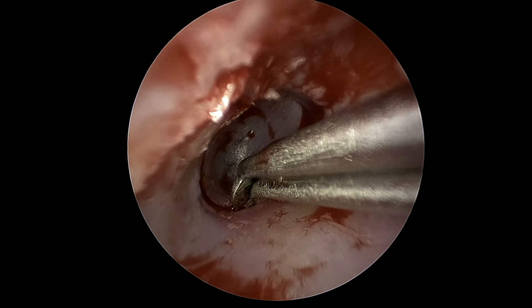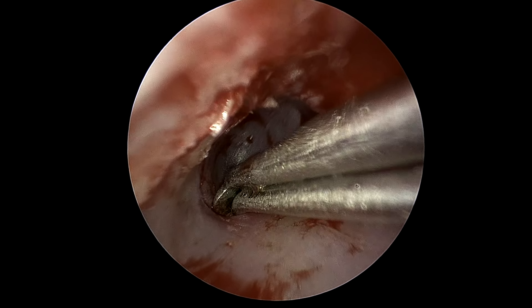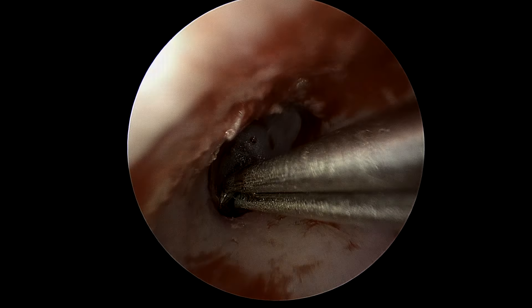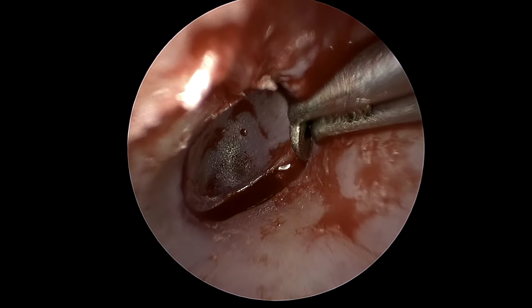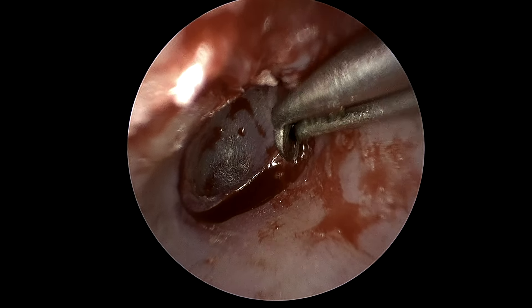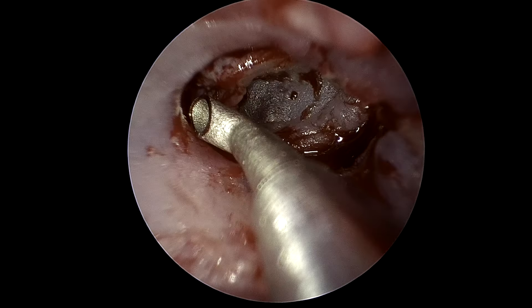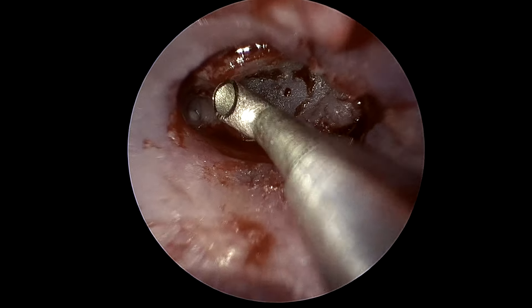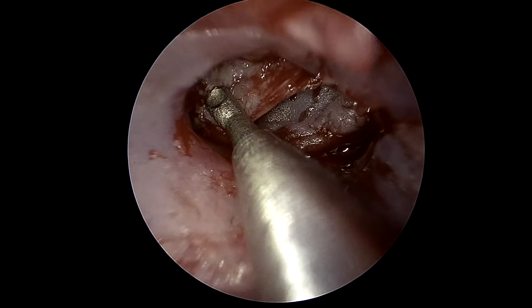Using a suction round knife, we then proceed to elevate the canal skin. Switching to a suction rosen, we continue our dissection, working on a broad plane.